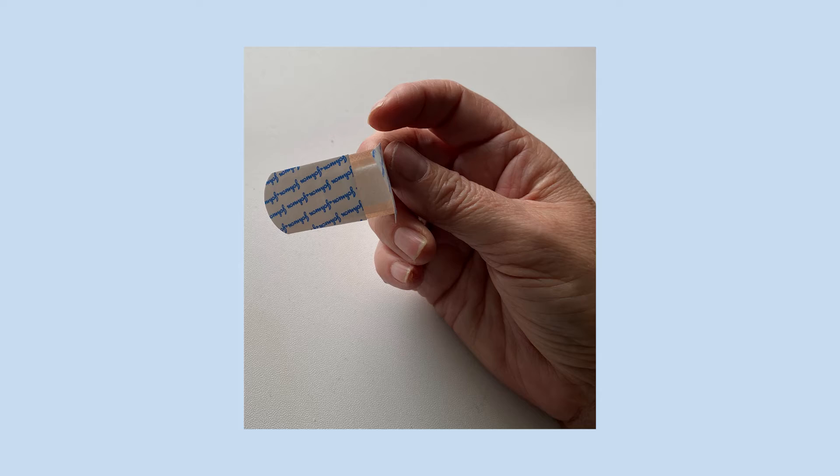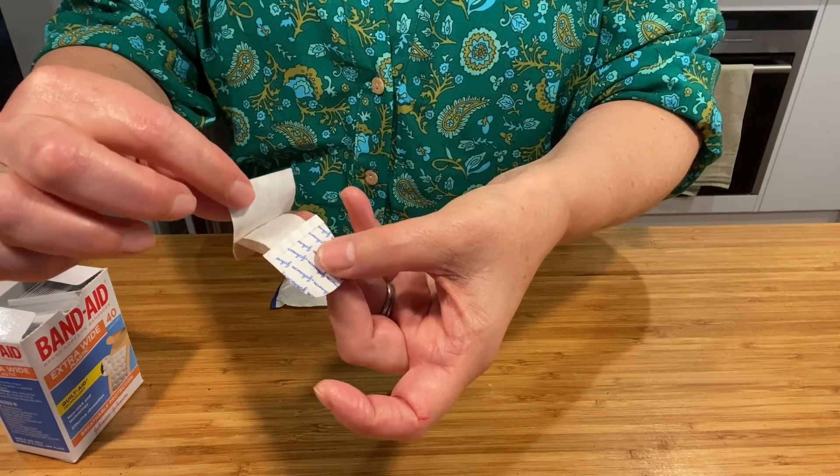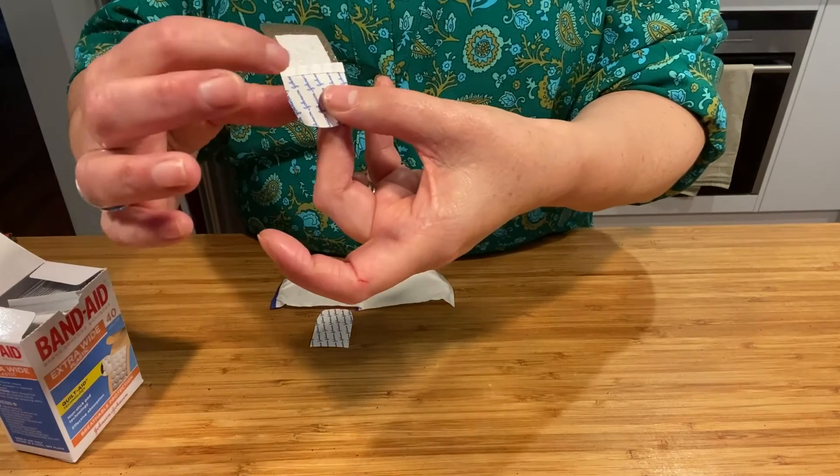When you have taken the band-aid out of the cover, turn it over and you will see there are two covers on the back of the band-aid. If you bend the band-aid, one of the covers will open and you can easily peel that one off.